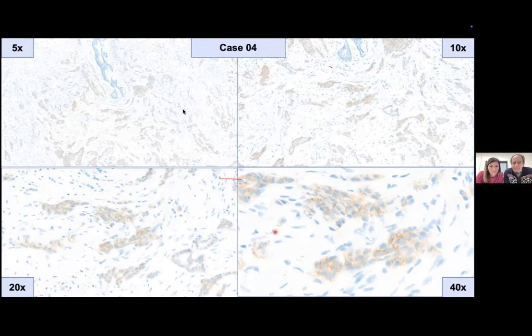Excellent. So remember this stepwise approach and come up with an answer. People scored 2+. Okay, some people, the majority, scored 1+, but some people scored 2+. What do you think, Simona? At times 5, I would not say I can see any membrane staining. At times 10, I'm still struggling, maybe here. So it's very occasional.